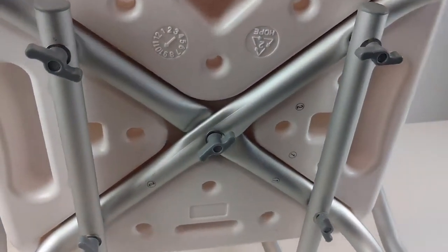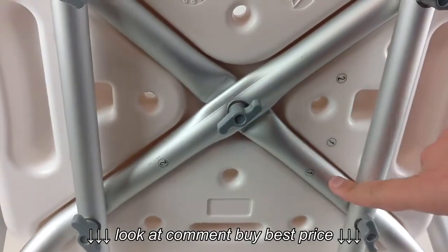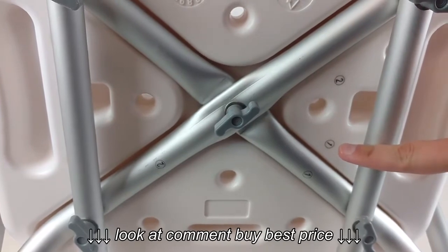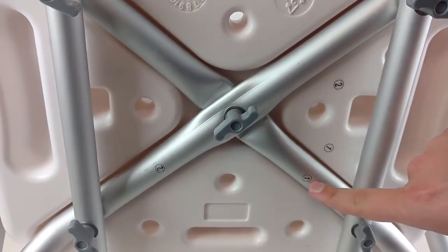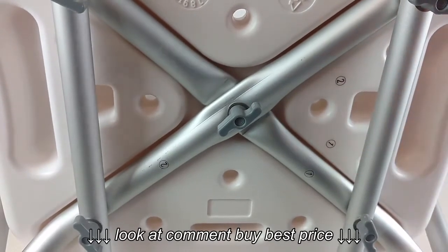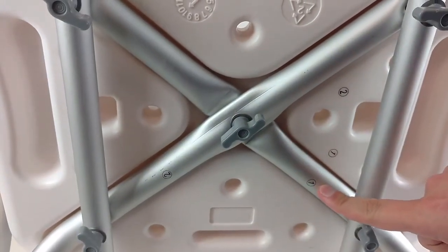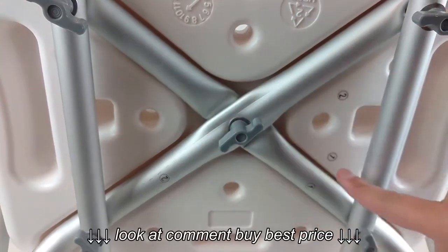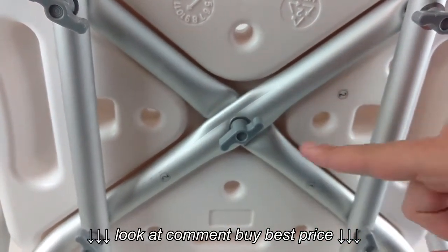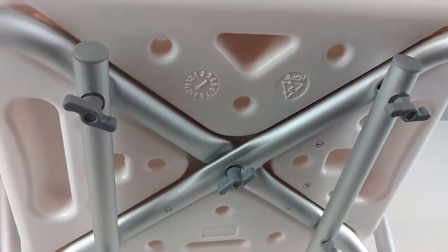The most common issue with this chair is the legs being in the incorrect position. Each leg is labeled one and two, and each track is labeled one and two, so you want those to match up. Leg section one will go in first into track one, with leg section two on top, and they're fastened together with a short hand screw and a washer.